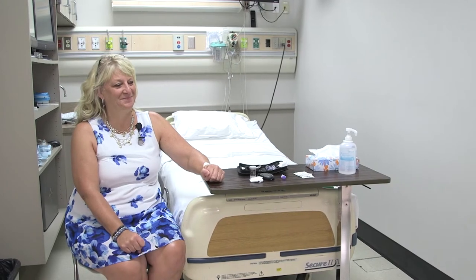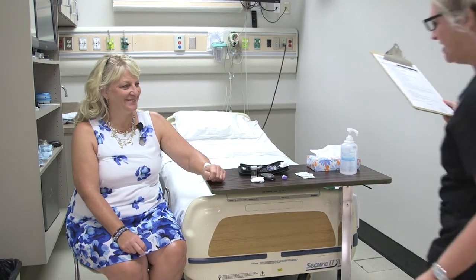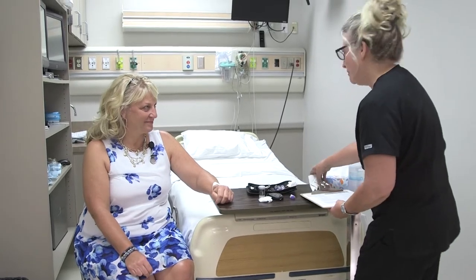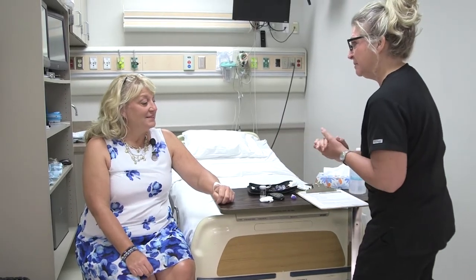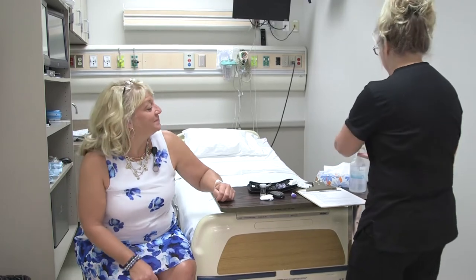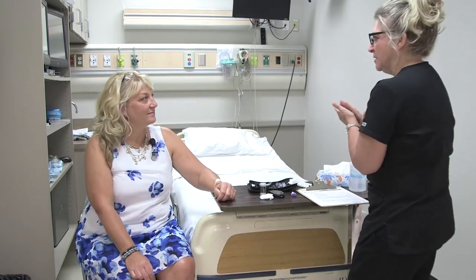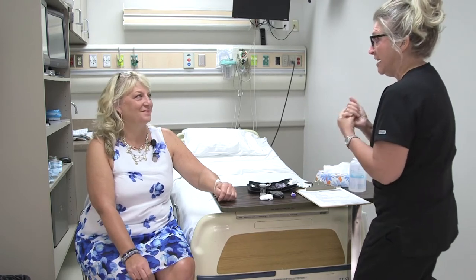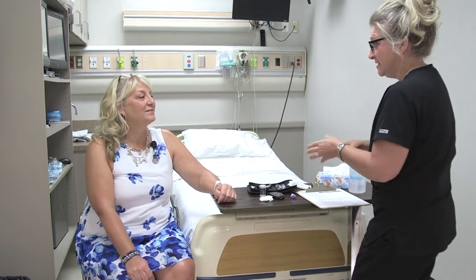Come in. Hi, good morning! Hello. So, how would you like me to address you? Sylvia. Okay, Sylvia, would you like me to call you by the name Sylvia? Okay, very good. Well, my name is Mary and I am one of the student nurses here at CVTC.